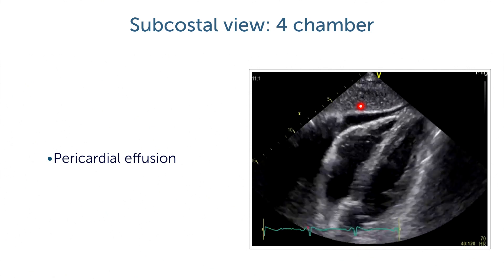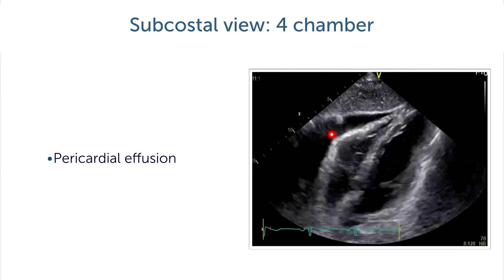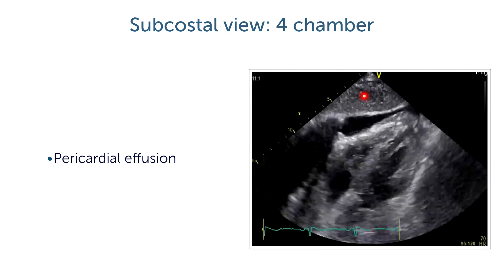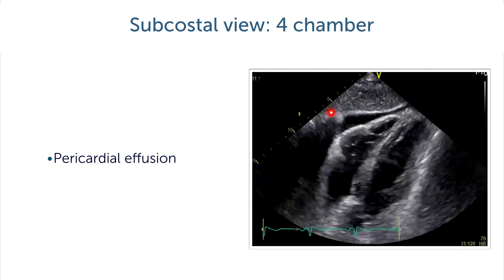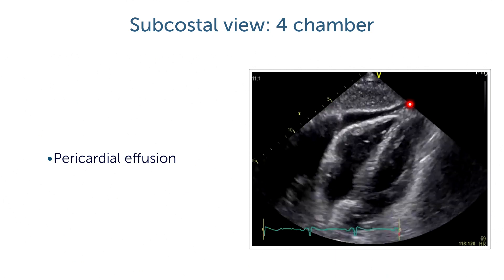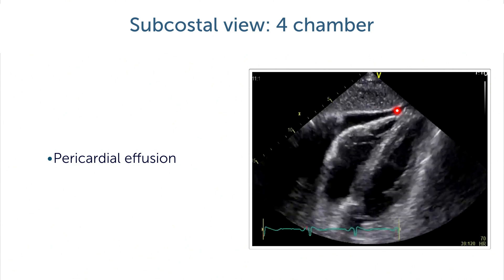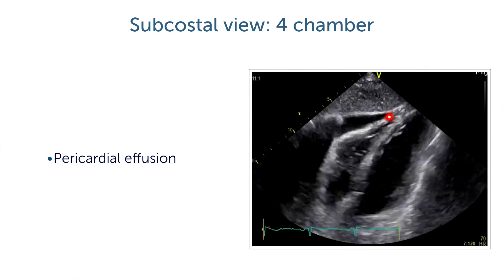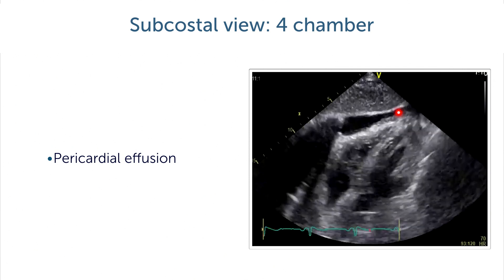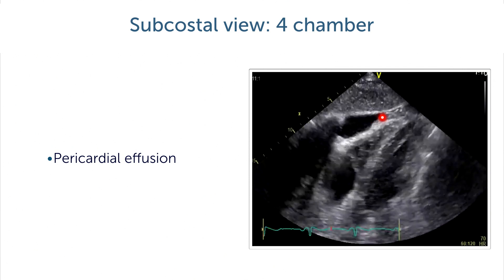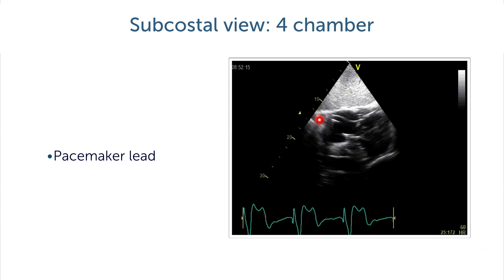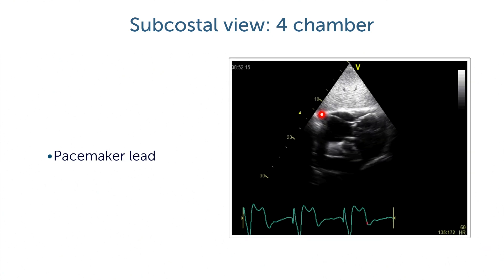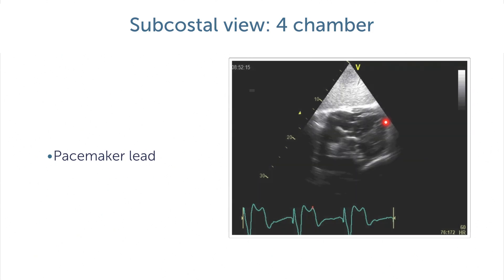Another very important reason to perform a subcostal four chamber view is the detection of pericardial effusion. Here we have a gap between the liver and the heart — this is the diaphragm and also the pericardium. This is the echo-free space. Some structures on the heart represent epicardial fat, but this here is the pericardial effusion. We can also look at pacemaker leads; this view is ideal to follow pacemaker leads as they go through the tricuspid valve into the right ventricle.